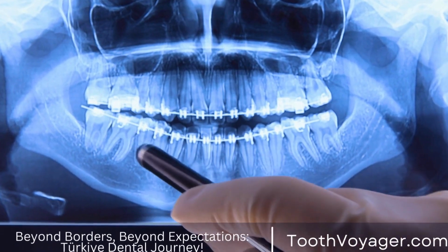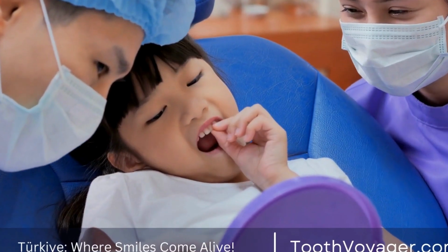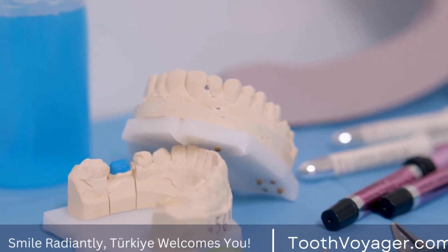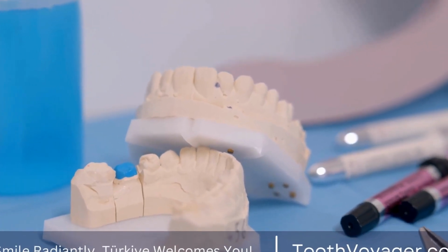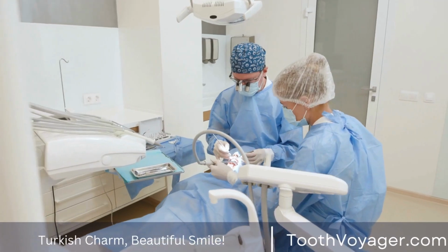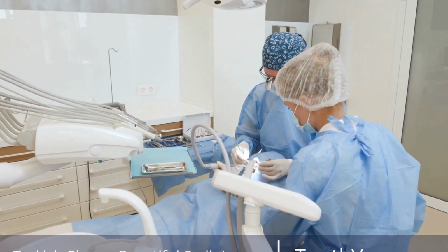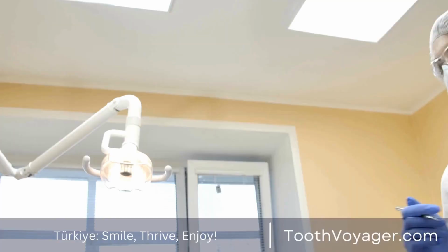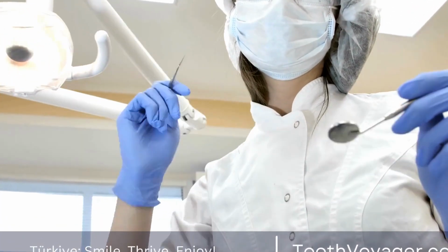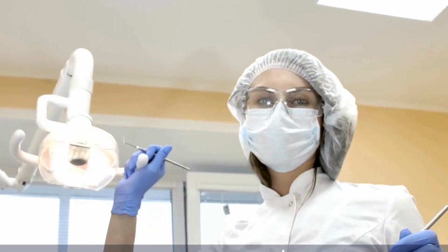Digital imaging and impressions. One of the key components of digital dentistry is the use of digital imaging and impressions. Traditional methods of taking dental impressions often involved messy, uncomfortable materials that patients found unpleasant. However, with digital impressions, patients can now have their dental impressions taken quickly and accurately using a digital scanner. This not only eliminates the need for messy materials, but it also provides more precise results, leading to better fitting restorations and reducing the need for adjustments.